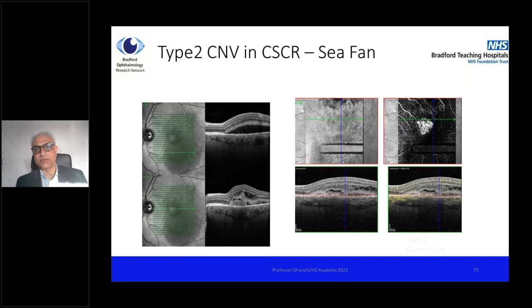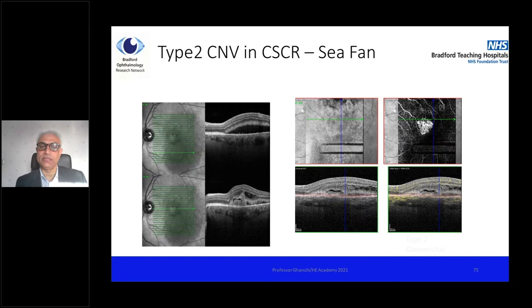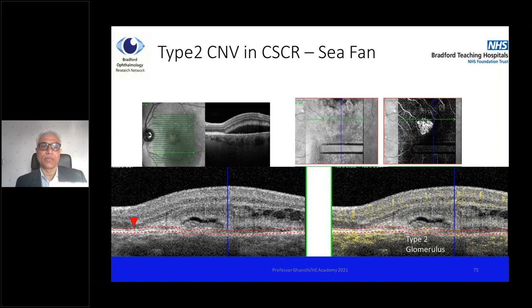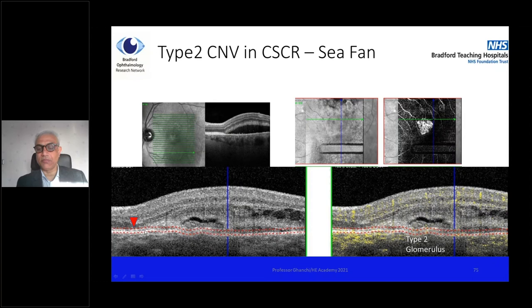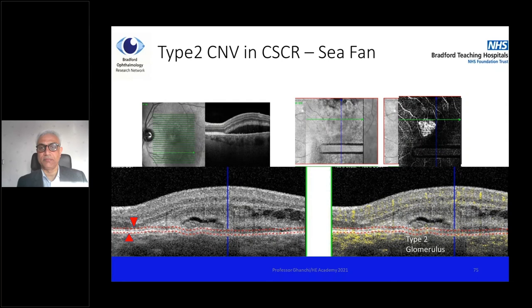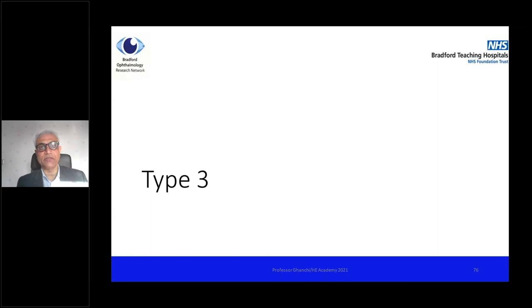Here is another example of type 2 CNV, easily picked up at the outer retina to inner choroidal junction. This was both type 2 and type 1 CNV in a patient with so-called CSR. The important thing to point out here is the slab — indicated by the red triangle in the bottom left corner. If you move that slab up and down manually, that changes the picture of the CNV you see on the top right en-face image. Depending on where the slab is, the appearance of the CNV on the en-face image changes. So it's a useful tool to use in your practice.